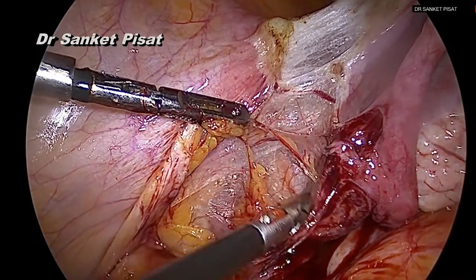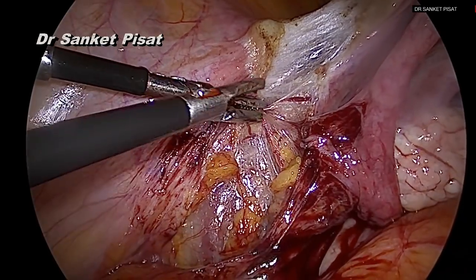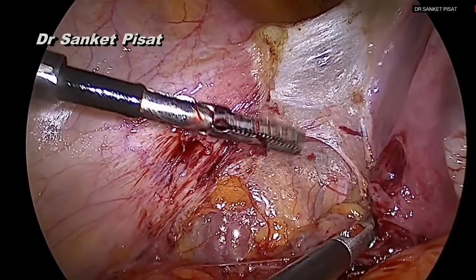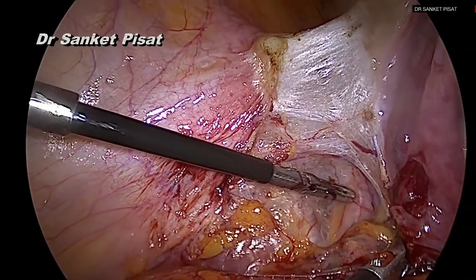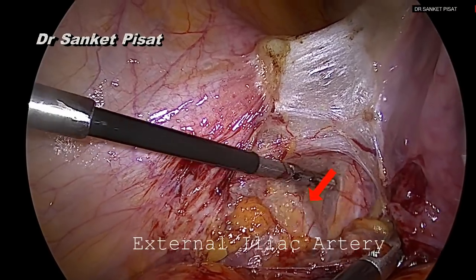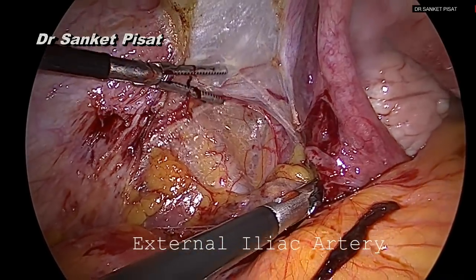As these transverse fibers are gently dissected, it is a good idea to cauterize and cut them, or to use a harmonic at this stage, because only blunt dissection will result in a lot of bleeding. Once some of the transverse fibers have been divided, the first structure seen laterally is the external iliac artery and underneath it the external iliac vein.